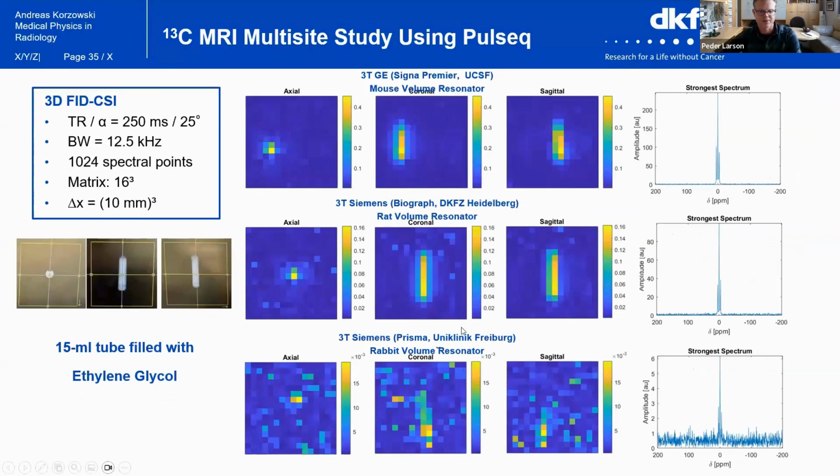These are great because you can pass them around on different scanners and different versions or types of scanner. So I like this approach a lot, or at least it's one of the best options I think we have if we want to do cross-vendor and keep things consistent.